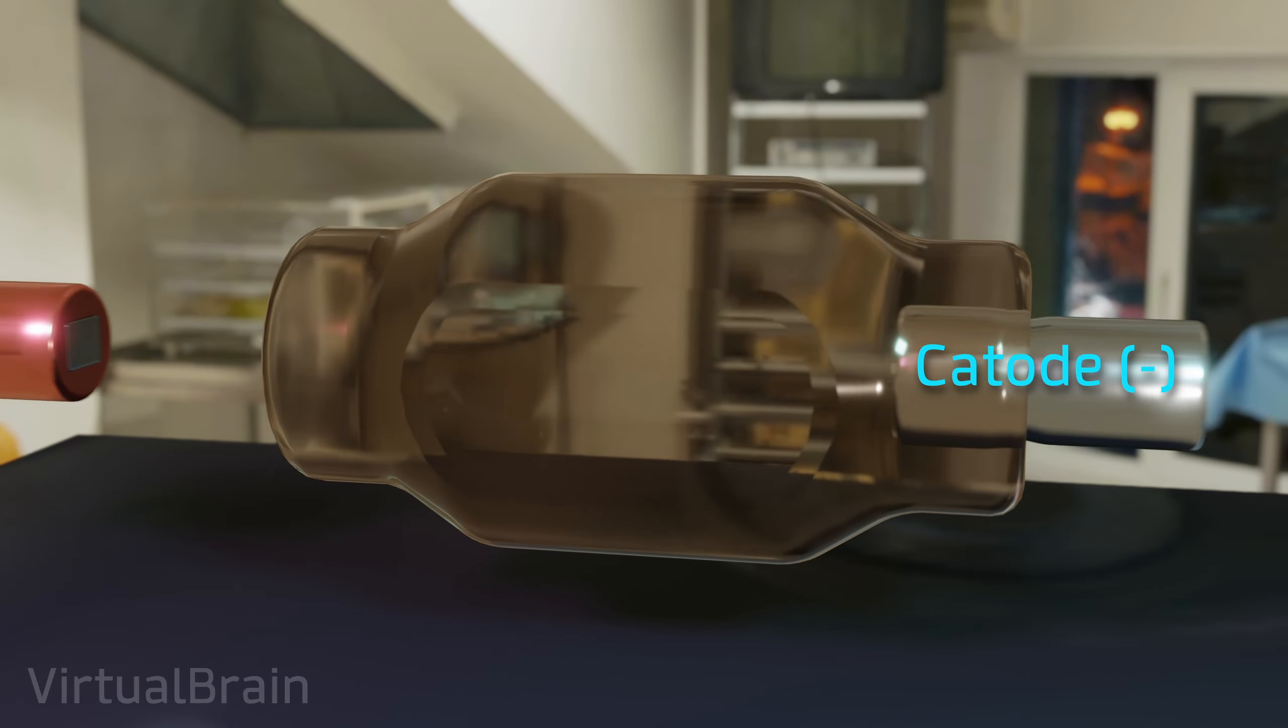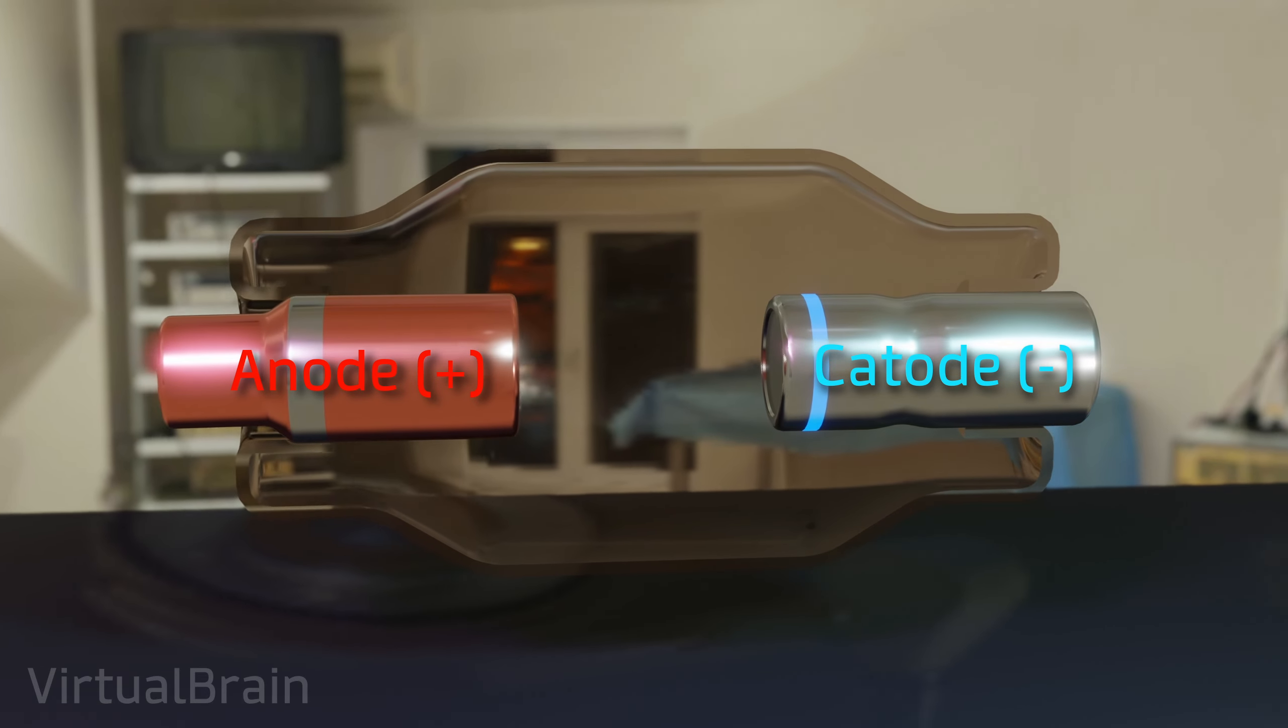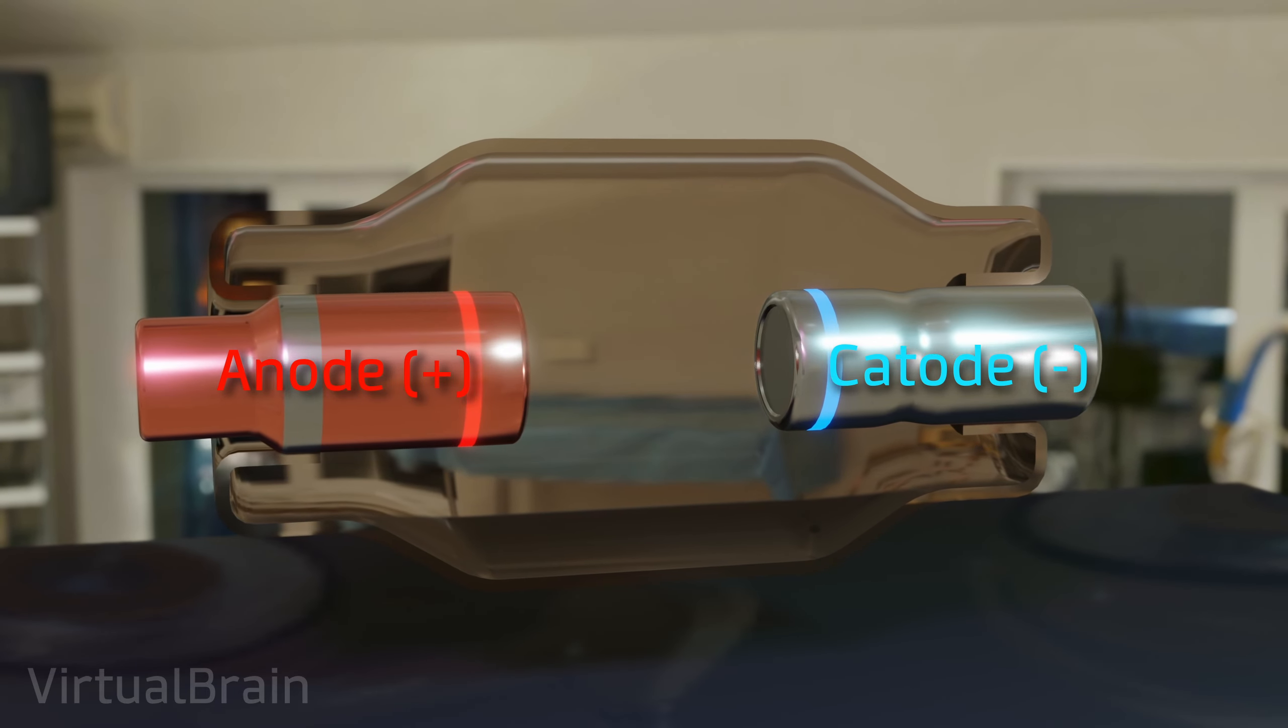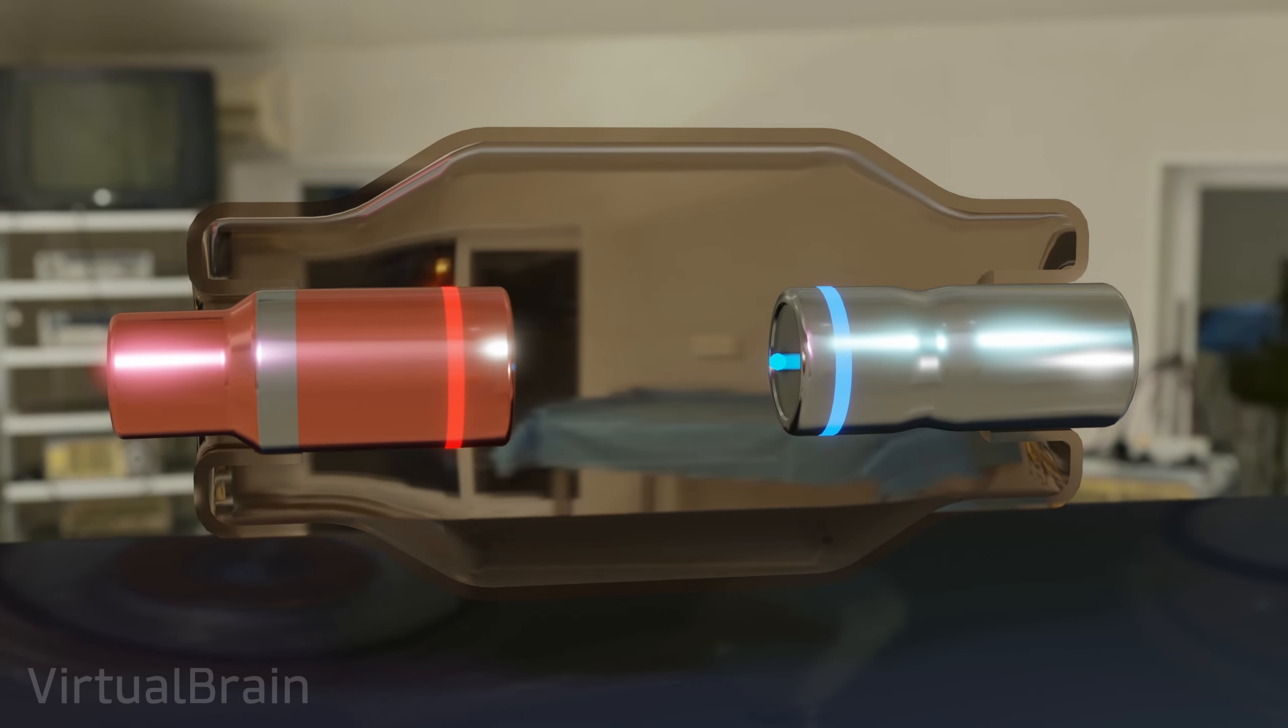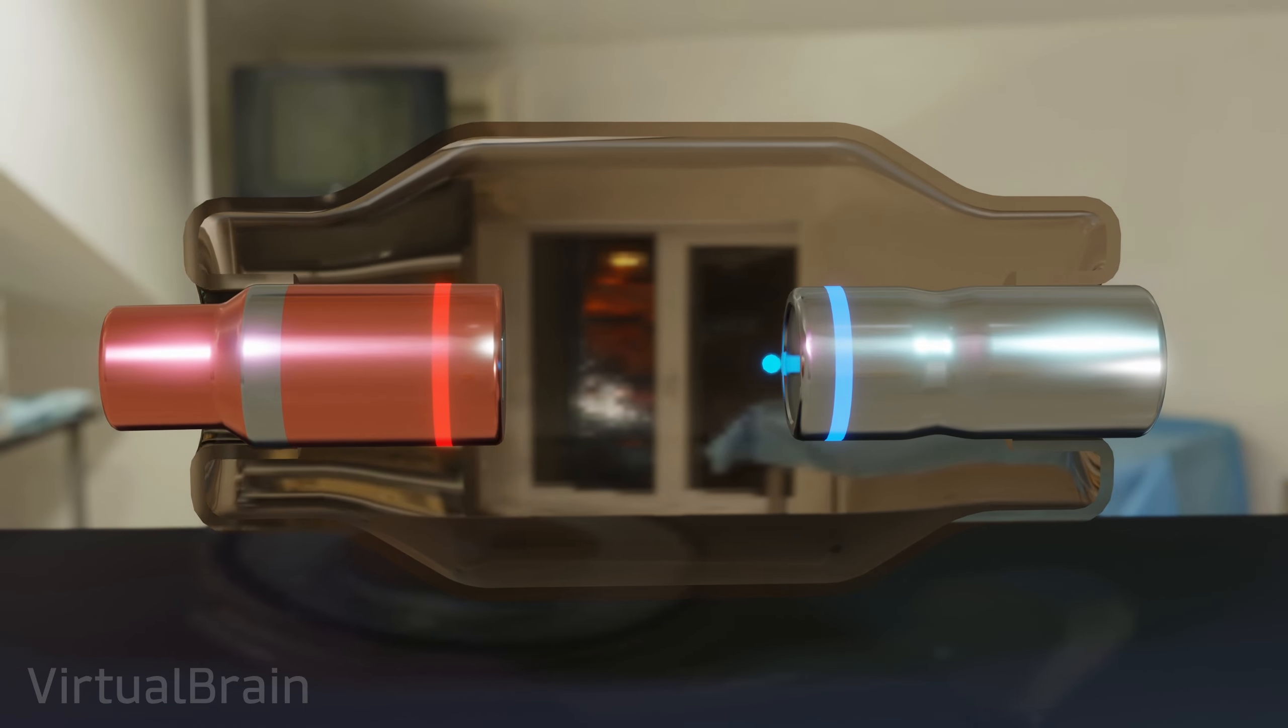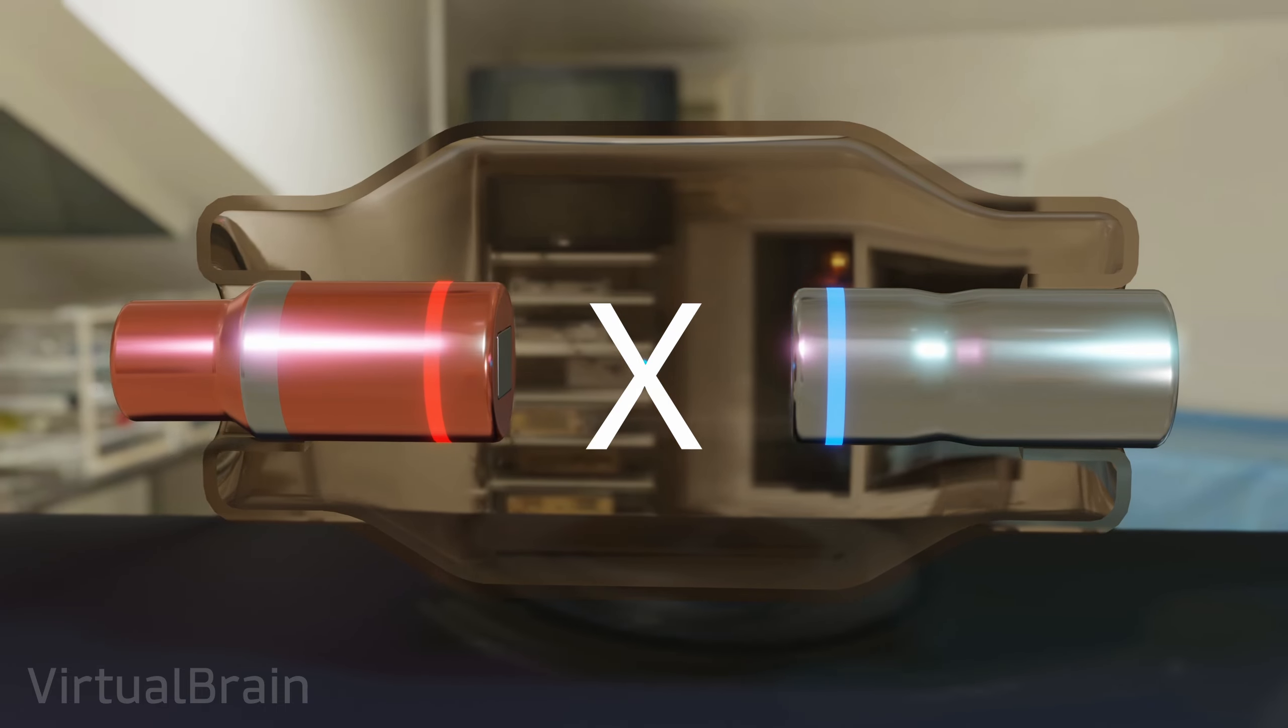Next, we will need a cathode and an anode, or in other words, a negatively charged electrode and a positively charged electrode. Since positive and negative charges attract each other, we might expect that free charges, or electrons, would move from the cathode to the anode. However, this will not happen naturally, as these components are physically separated.